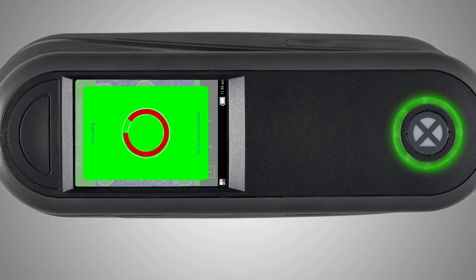A green box will be displayed when the measurement is complete and it's safe to move your instrument. The circle LED light will also be green.